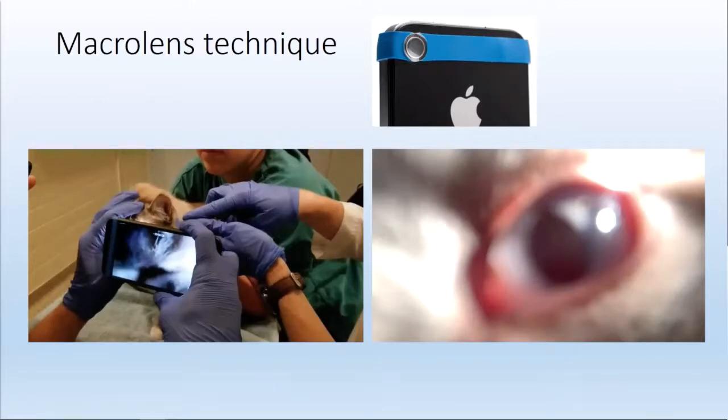You can take screenshots of these, if you don't want to send a video or if it's too large. You can just pause the video, scroll to the portion that's most representative, take a screenshot, and then just send a smaller shot as a smaller file.